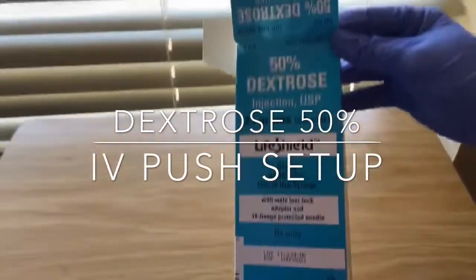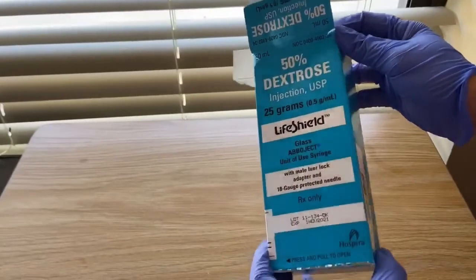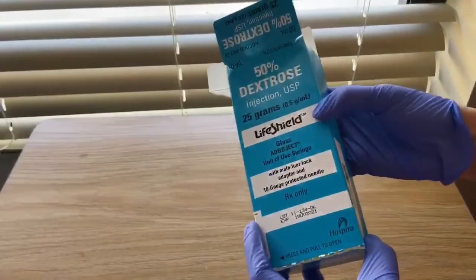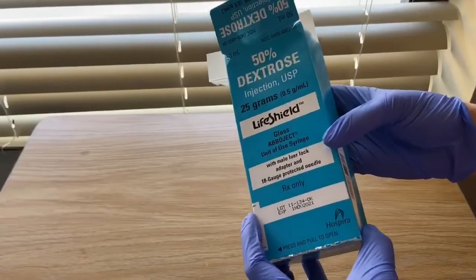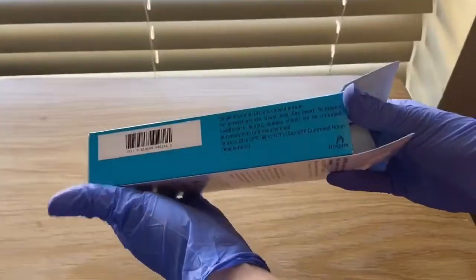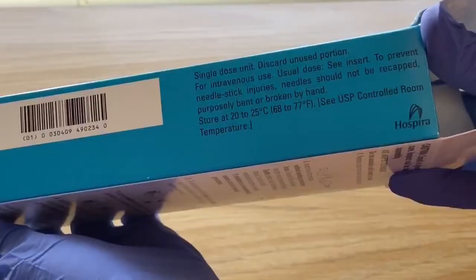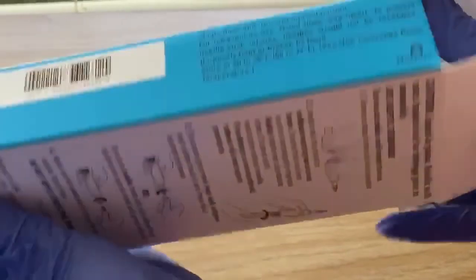Hello guys and welcome to R&Scrub. Today we're going to be showing you how to prime and set up the dextrose 50%. It doesn't really matter what type of dextrose you have — dextrose 50%, 25%, or even 10%. We work in the adult ICU, so that's why we have a single dose unit of the 50% available to us.